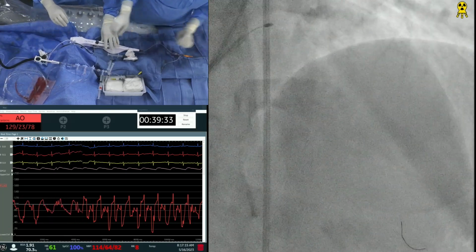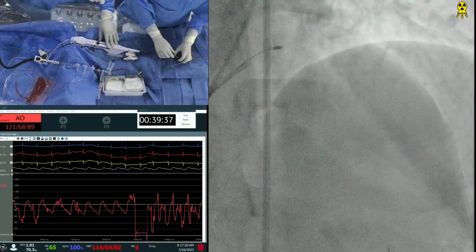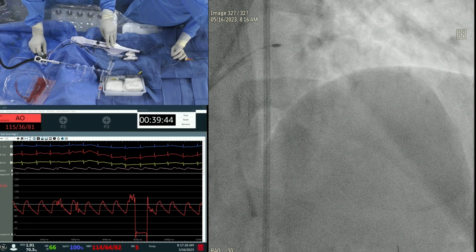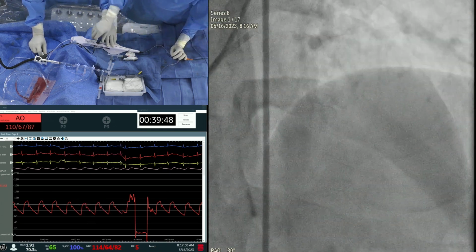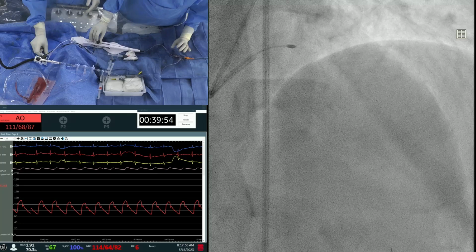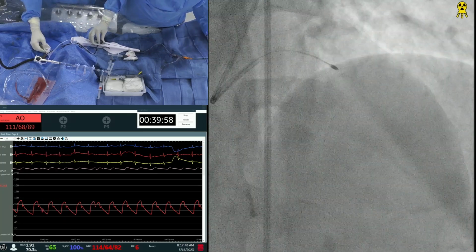Would you be going into the more distal of the two lesions with the rotablator, or just the bifurcation site? I think just the bifurcation site. Is there calcium there? I think this is reasonable to call. No, it is there, it goes further. Yeah, we'll do that at 3 o'clock. Okay, we are ready with the 1.5 burr at the rota, drive floppy.